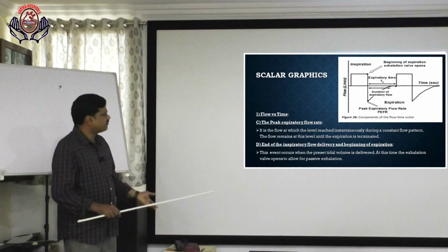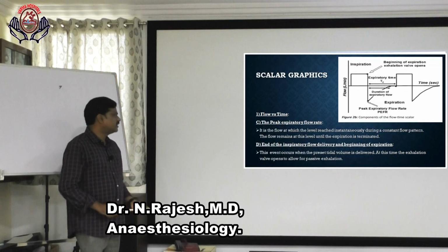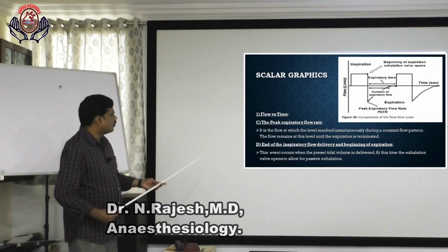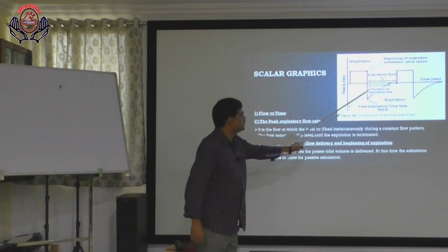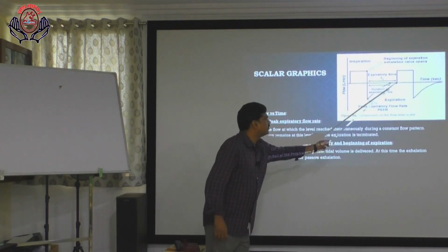End of the inspiratory flow delivery and beginning of the expiration. This event occurs when the preset tidal volume is delivered. At this time, the exhalation valve opens to allow for passive exhalation. This indicates the duration of expiratory flow. This is the expiratory time, TE.